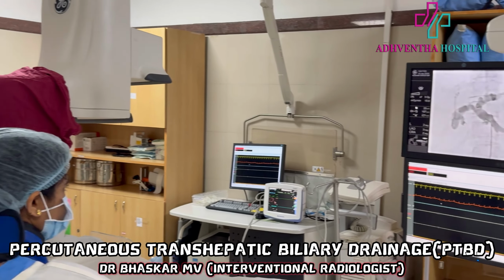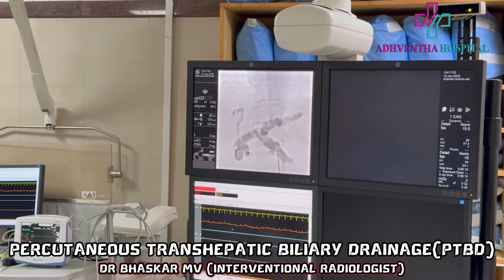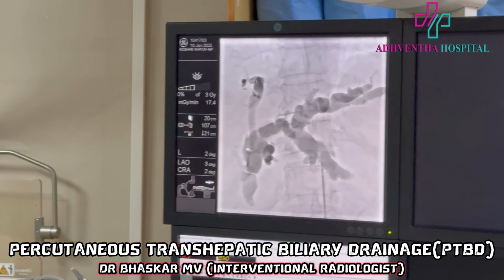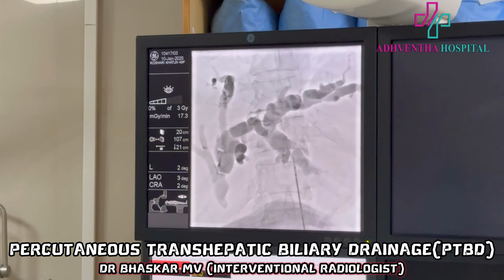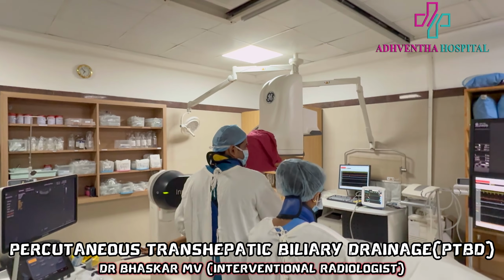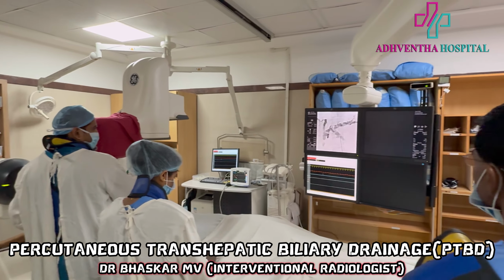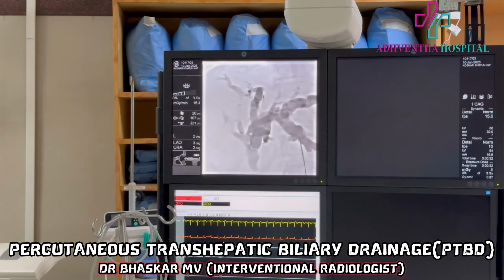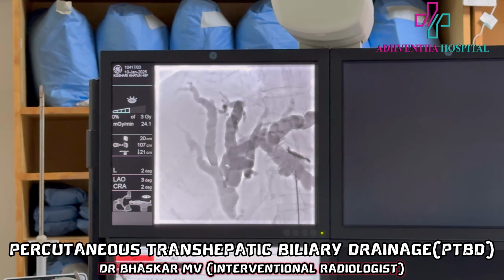So now show the screen. Yes. So this is a grossly dilated biliary tree. Wire is ready. 7 French sheath or 6 French sheath, can you give? Show the left and right lobe. Can you see? So that's the obstruction.